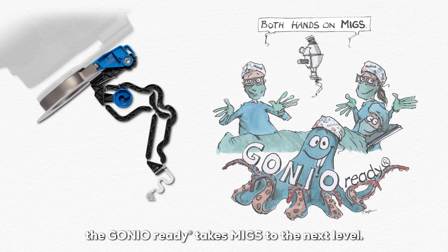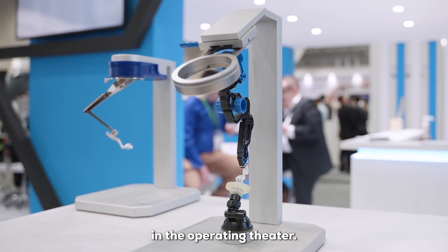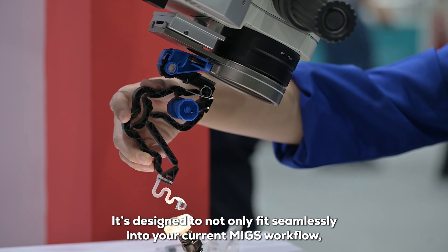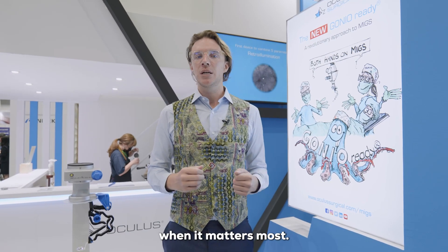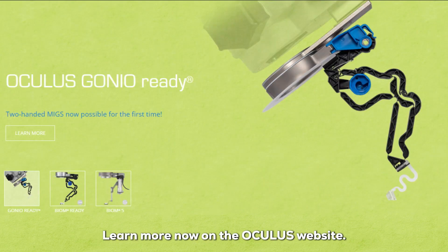The GONIO Ready takes MIGS to the next level with the flexibility and freedom it offers surgeons in the operating theater. It's designed to fit seamlessly into your current MIGS workflow and improve your surgeries by allowing surgeons to have all hands on deck when it matters most. Elevate your MIGS game with the GONIO Ready — learn more now on the Oculus website.